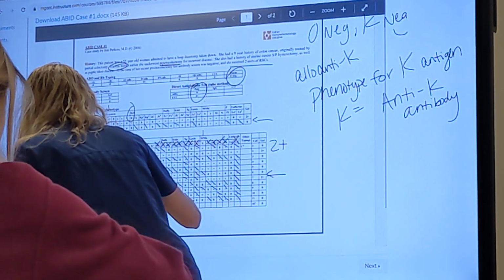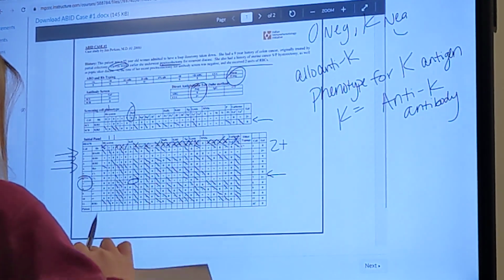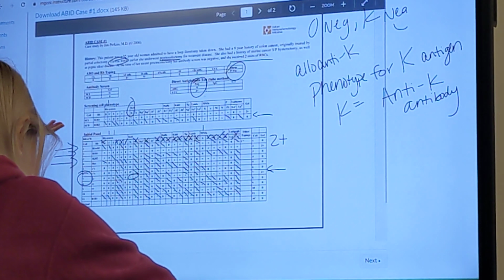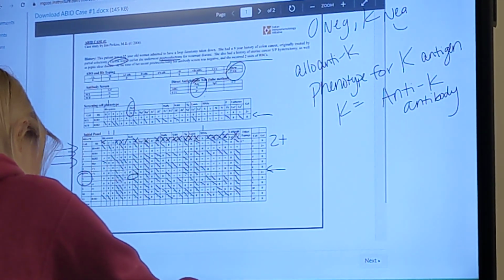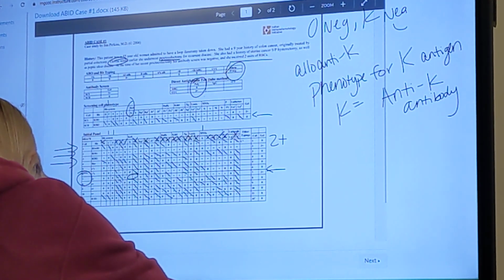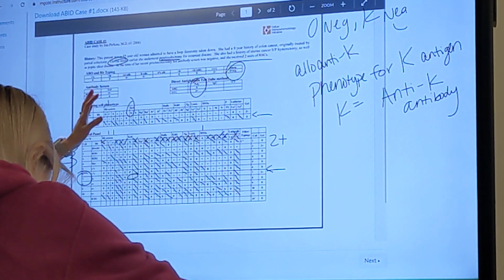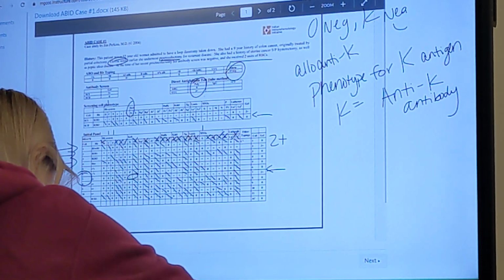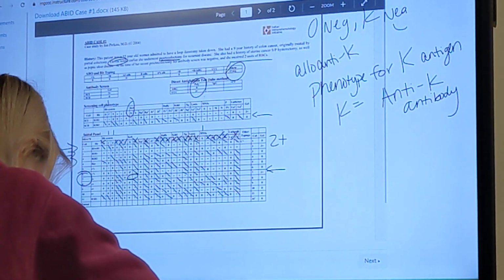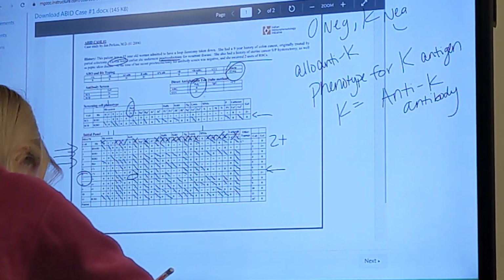Ten of the 12 are Kell negative. Most people don't have it. So that's two people out of 12 or 13, whatever I said. If you're trying to think of frequency and you can't remember which one's which: if everybody has the antigen, it's high frequency. If it's positive on all of those random people. If they're all negative for the antigen, then it's a low frequency. And that kind of tells you whether you need to worry about it or not.